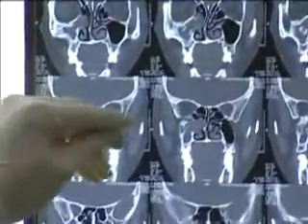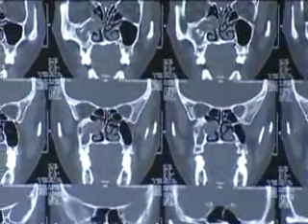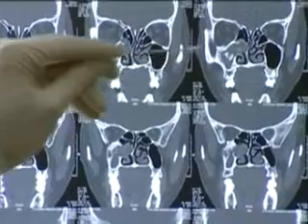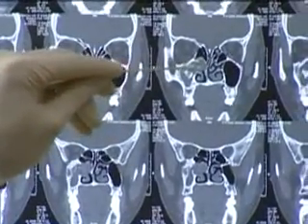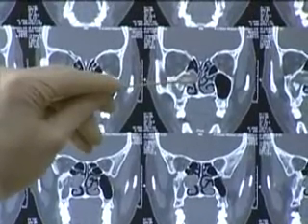Further back, some calcification. The rest of the other sinuses are all right. So this is basically a limited disease in the maxillary sinus. What I would plan to do now is to go inside, biopsy some of these specimens for culture and section, and then we'll try to take all these out.